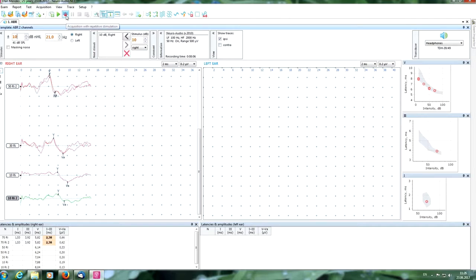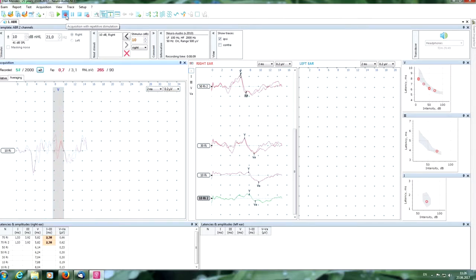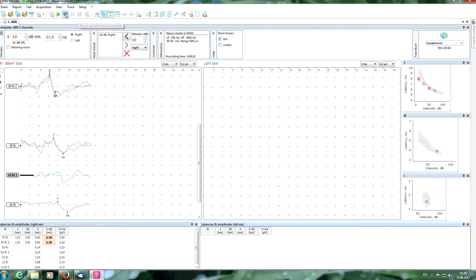Okay, and start stimulation with chirp stimuli. As you can see here, the 5 wave starts to organize. The amplitude is enough. We can see the process. As you can see, we use only 1000 averages now, and we get the 5 wave on this quantity. We can stop and repeat.